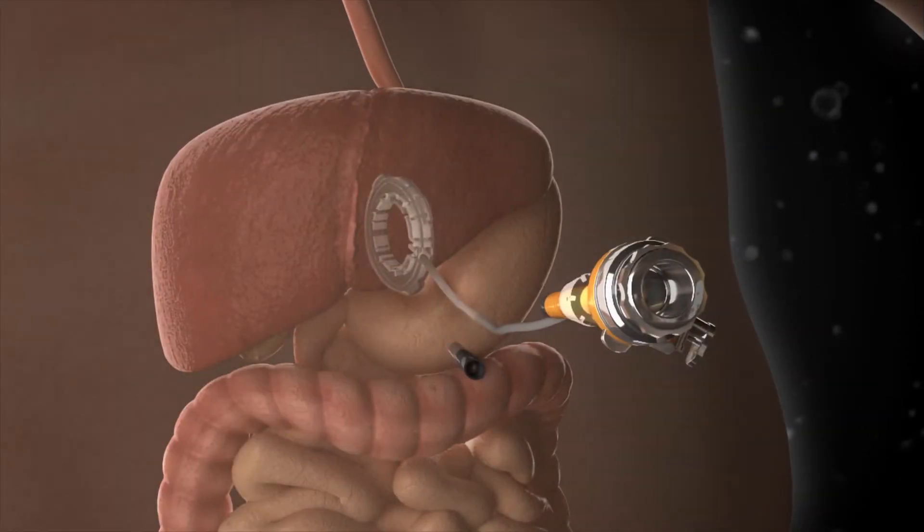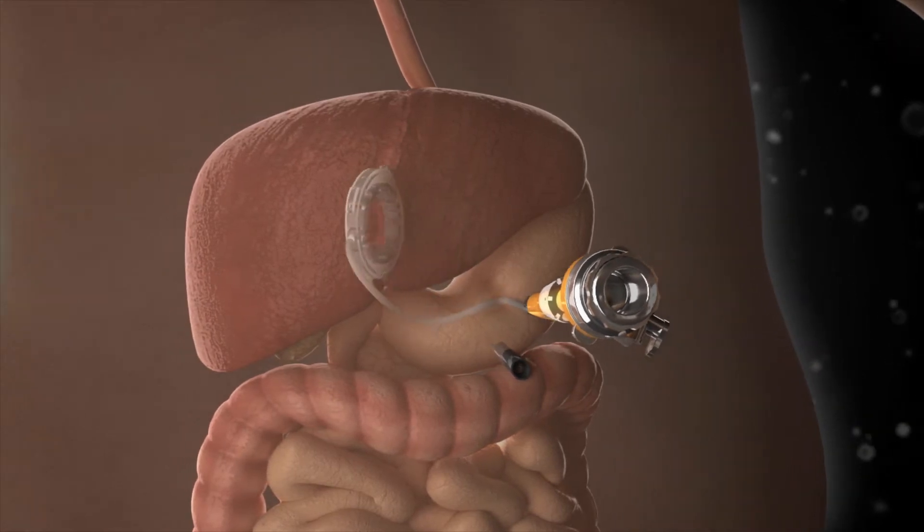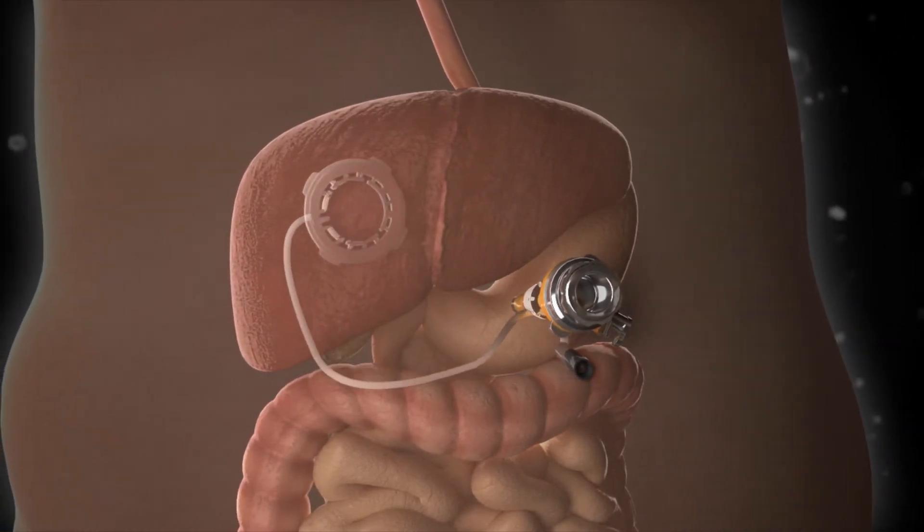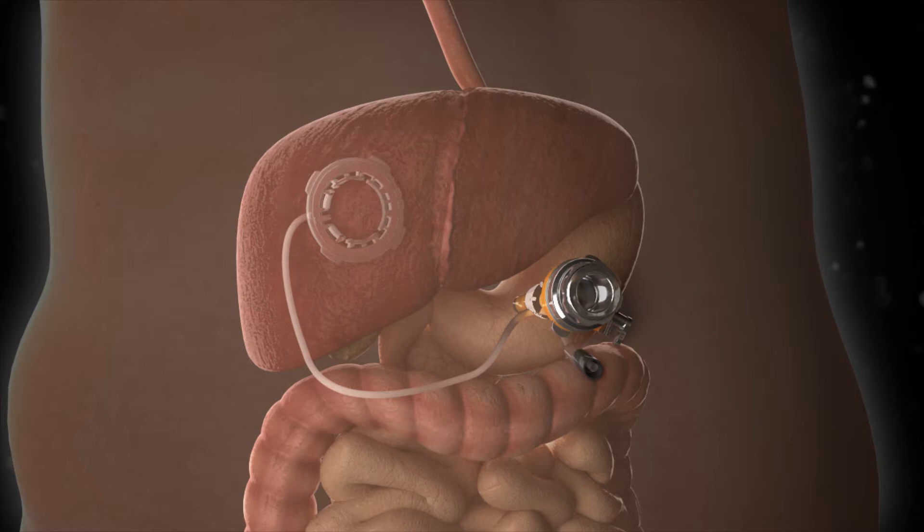The Livac retractor is inserted via an existing port incision and positioned between the liver and the diaphragm, and connected to suction.